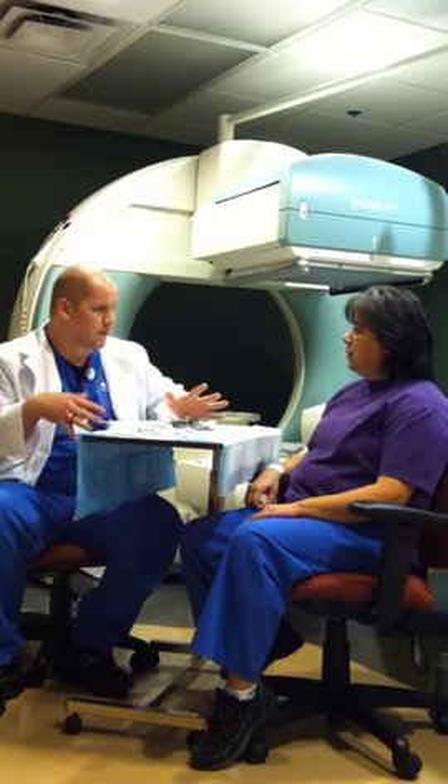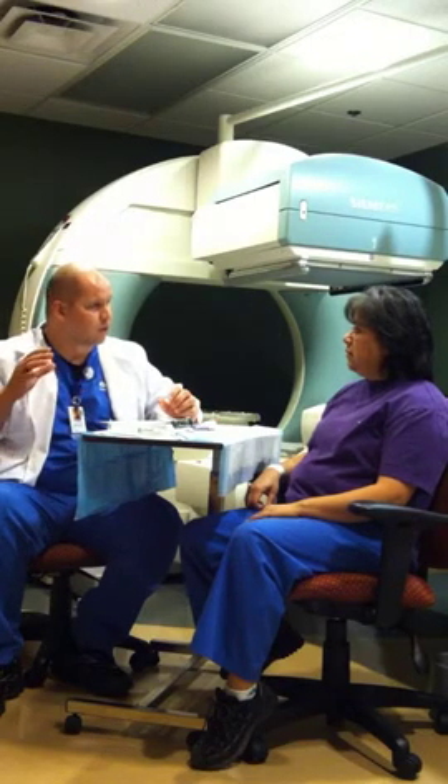So what we're going to do is go ahead and start an IV, and we're going to give you an injection of a chemical called pyrophosphate, or PYP. It's not going to do anything to you — you're not going to feel anything. But what it's going to do is prepare your red blood cells for the imaging agent that we'll inject in about a half hour after that. Think of it as like primer — when you're painting something, you put on primer so the paint will really stick to the surface. This PYP is going to act like that for your red blood cells.